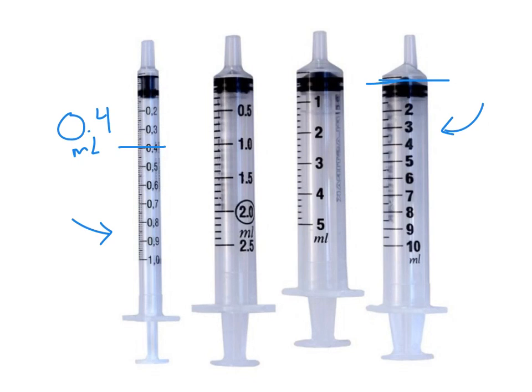So it wouldn't make any sense to use a 10 milliliter syringe. I would use a 10 milliliter syringe when I needed to give a lot more. So maybe 8, 7, or 9.5 milliliters. 9.5 milliliters would be halfway between 9 and 10. So that's what we would use the 10 milliliter syringe for.